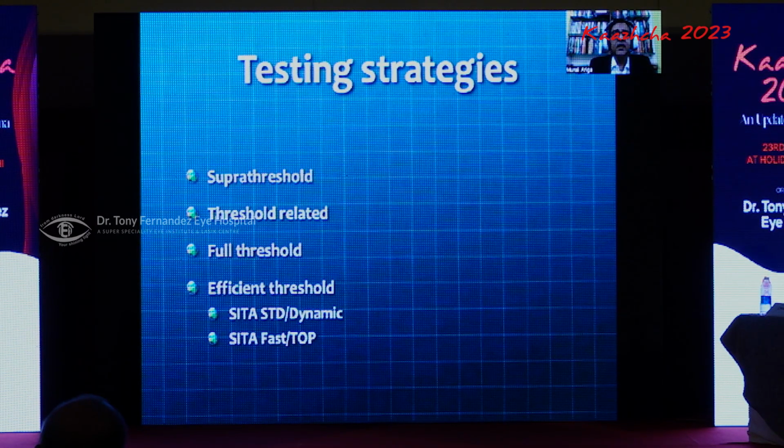Between dynamic and TOP, for a patient who is doing it for the first time, I would suggest you start off with the SITA Standard or the G dynamic for the Octopus. If your patient is well versed with perimetry and does it very well and efficiently, then you can switch to SITA Fast.